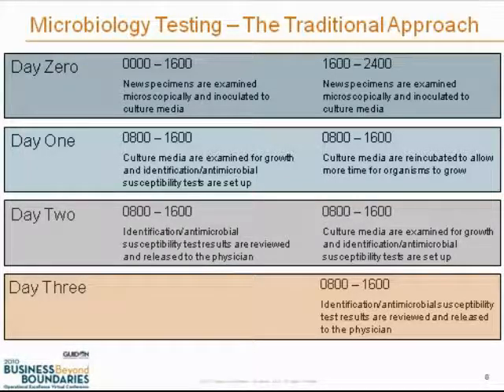Now, during both of those time slots in the day, on day 0, new specimens are arriving in the laboratory, and they are being examined microscopically and inoculated to culture media. So day 0 between those two time slots is pretty much the same. However, where we see some departure is on day 1.